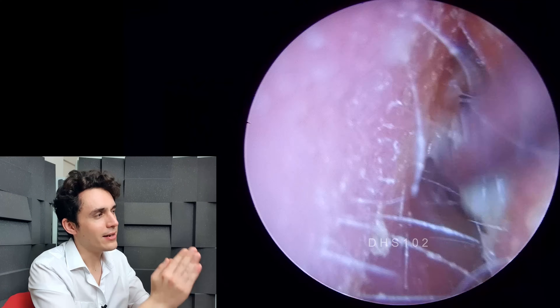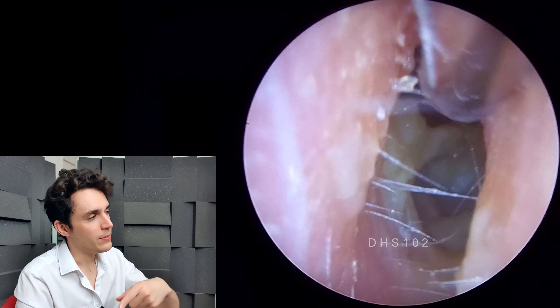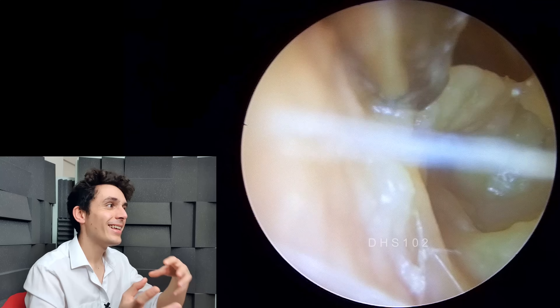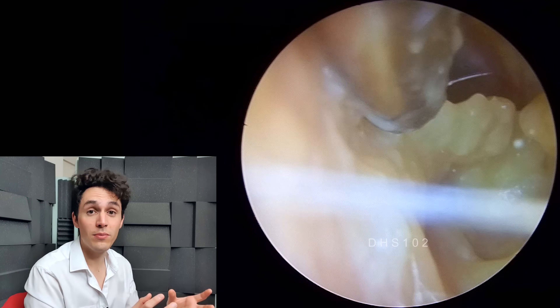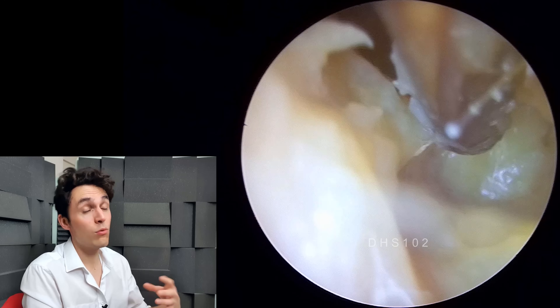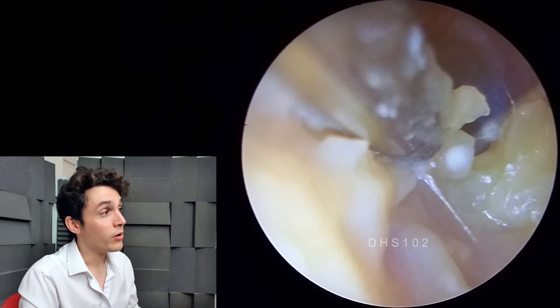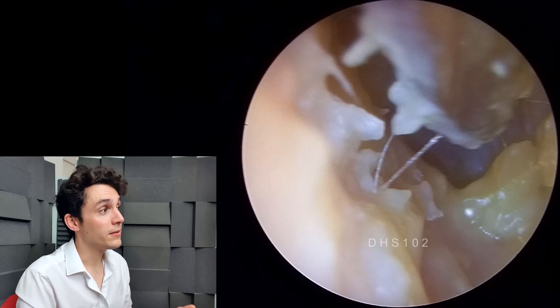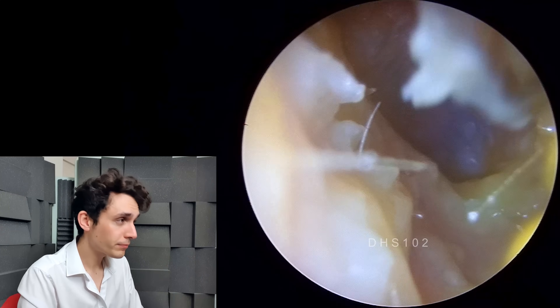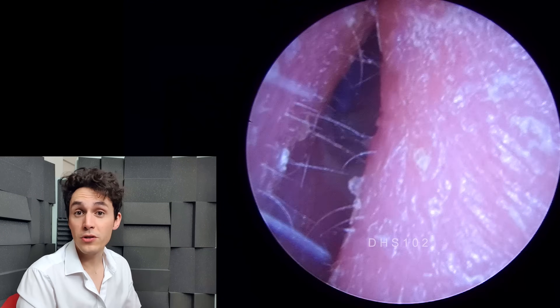You can see just how narrow the ear canal is on this side compared to the normal ear. Just flicking back quickly to the terminology — the term swimmer's ear and surfer's ear seem to be used quite interchangeably depending on where you live in the world. In the UK, when somebody says swimmer's ear to me, I'm usually thinking a bacterial infection of the outer ear. Whereas if somebody says surfer's ear to me, I'm usually thinking this is an ear canal with bony growths in it, which we call exostosis, which I featured on another video. You get these bony growths if you're continually exposed to cold water.